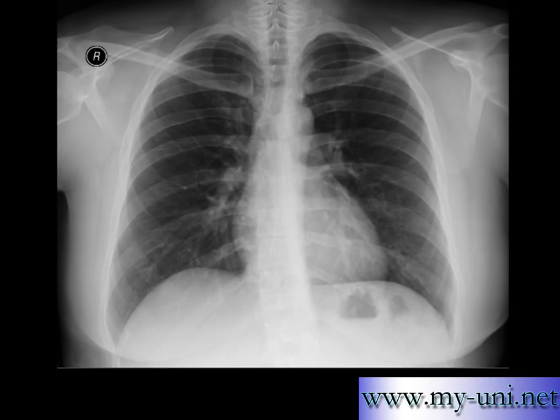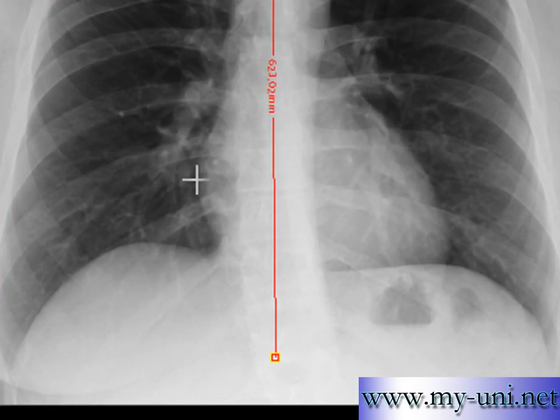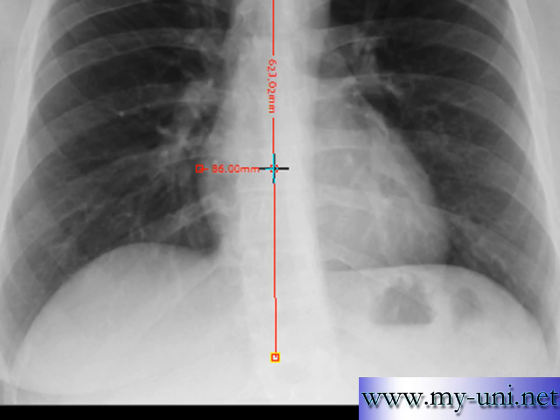Draw a vertical line right from the start of the thoracic cavity down to the level of the diaphragm. One third of the cardiac shadow lies on the right hand side and two thirds of the cardiac shadow lies on the left hand side of the patient. Find out the maximum extension of the cardiac border on the right hand side and make a measurement from this extension to the vertical line you just drew.